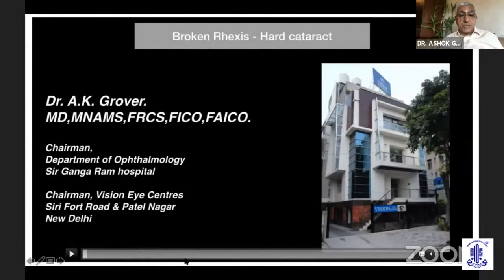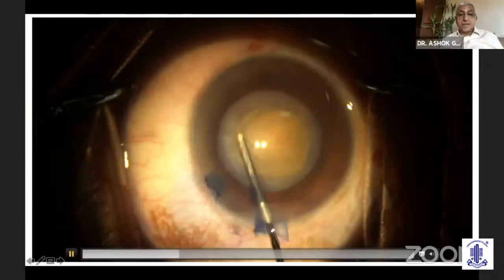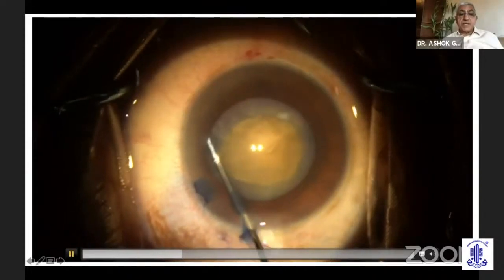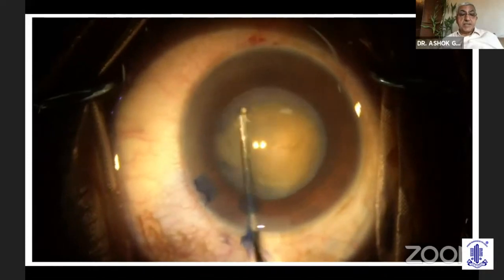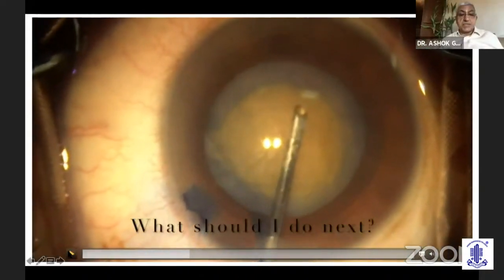So at that moment, the capsule has snapped. This is the moment we are pushing in the fluid and the capsule snaps. So now we have to think of our options.